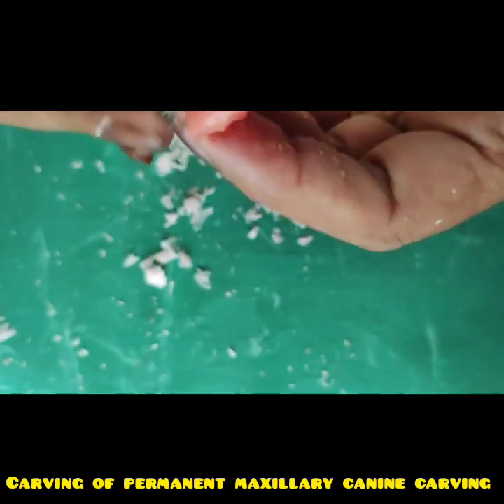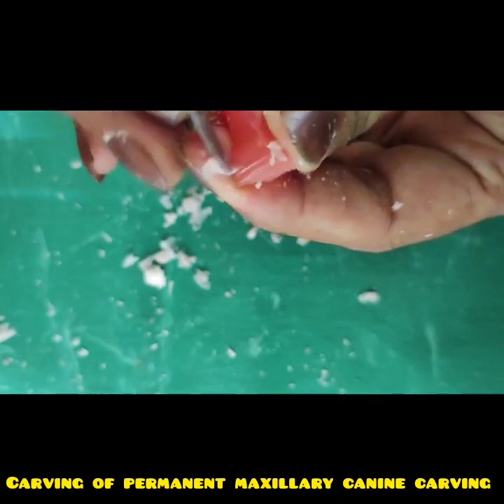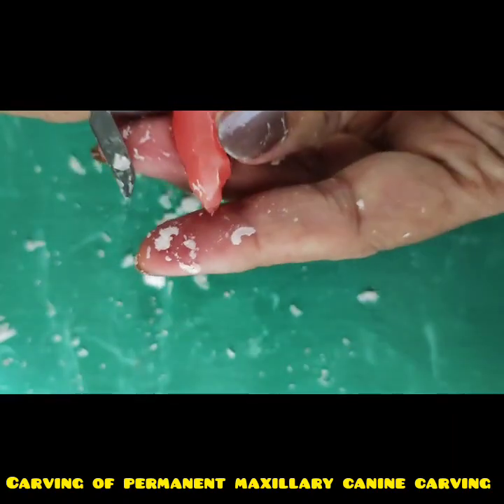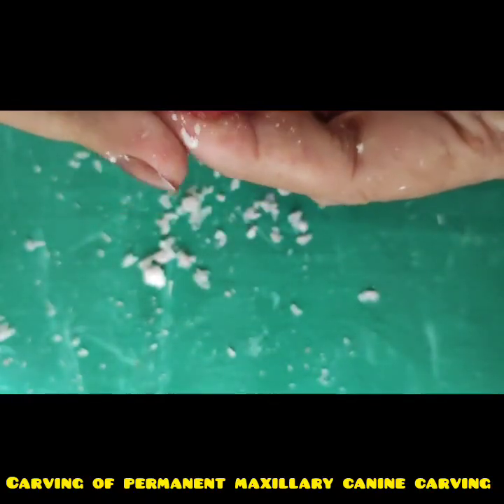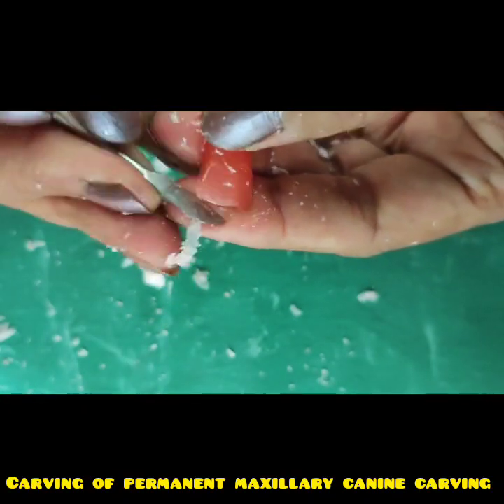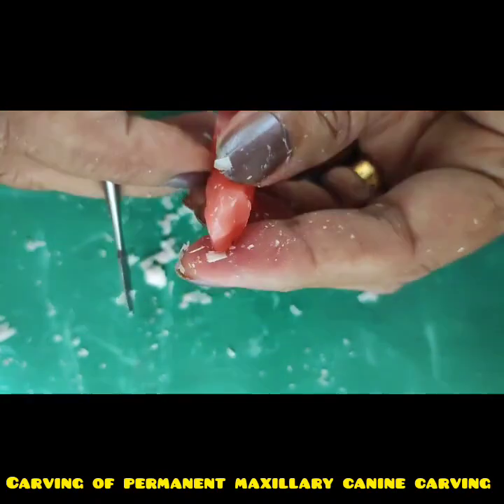And maintain the central axis of the crown. That means if you join the root axis and the crown axis, it should fall in the center of the crown. Demarcate the inclined planes on either side of the labial ridge like this.